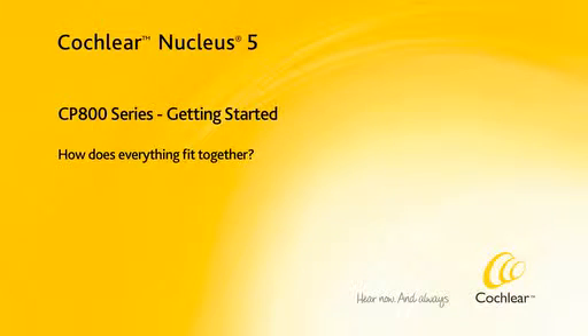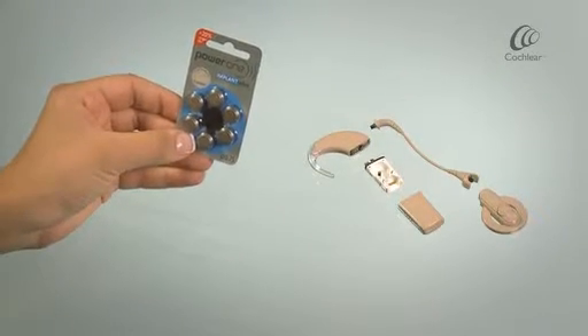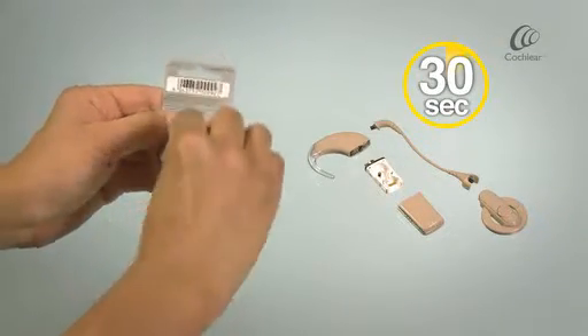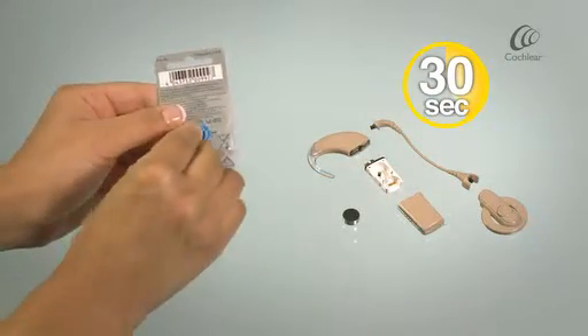How does everything fit together? Remove your zinc air batteries and then let them sit for 30 seconds. This will maximise the life of the batteries.